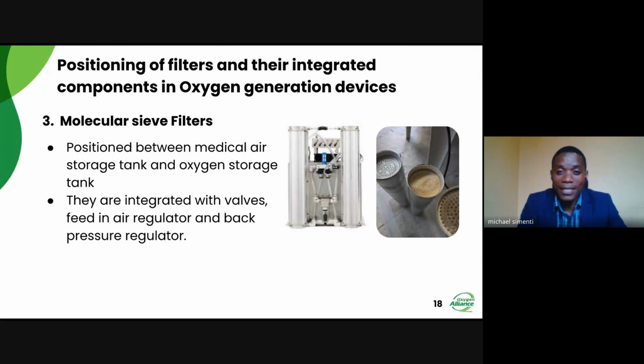The other picture that you see on the right-hand side of that slide is zeolite, which is inside the sieve beds. For them to achieve their functionality, there are also some other components that are always connected to them. For example, the valves which open and close, letting air go into the sieve beds and also letting the nitrogen which was trapped go out of the sieve beds.